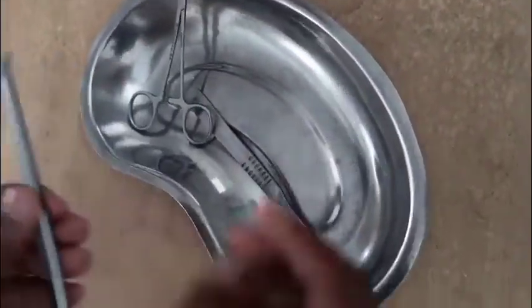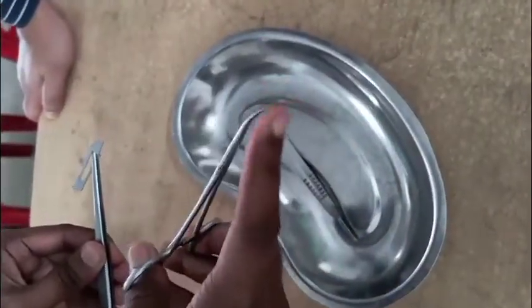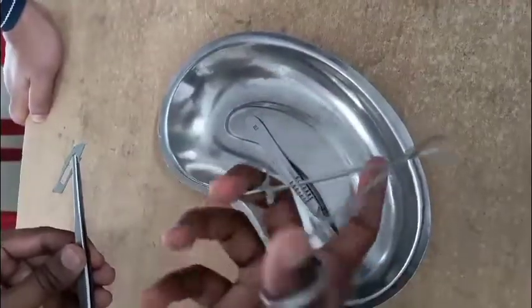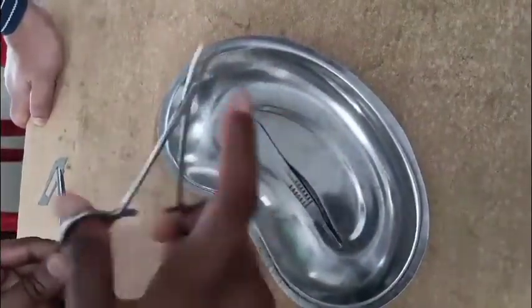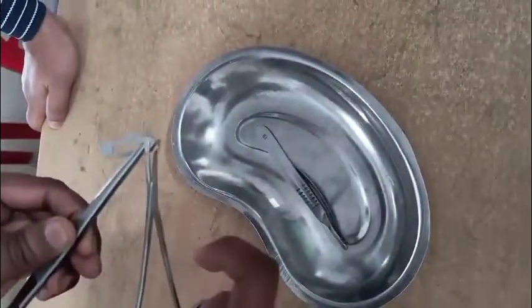This is our BP blade. After that, you have to grab the mosquito artery forcep. This edge will be directed outwards, and by our middle finger and thumb we will place this, and by our index finger we will have support here.